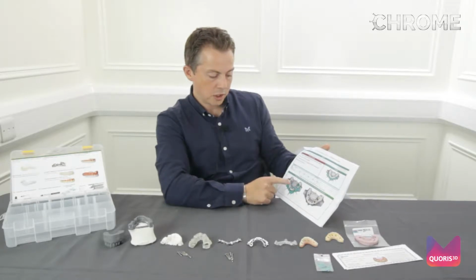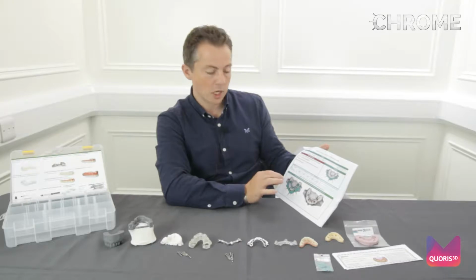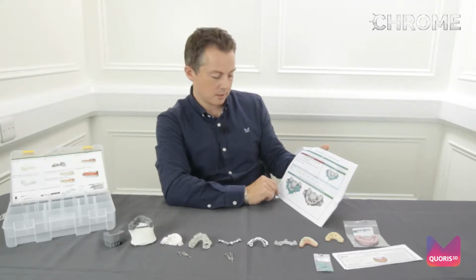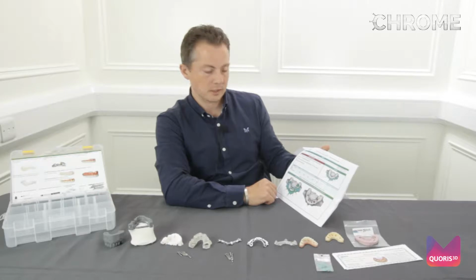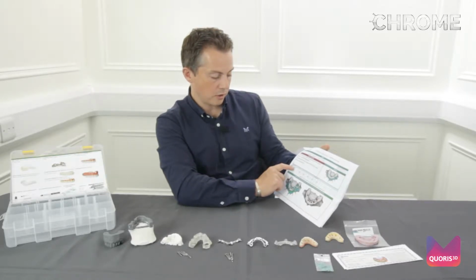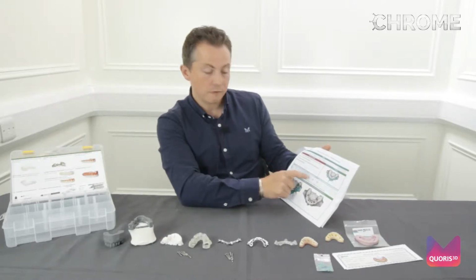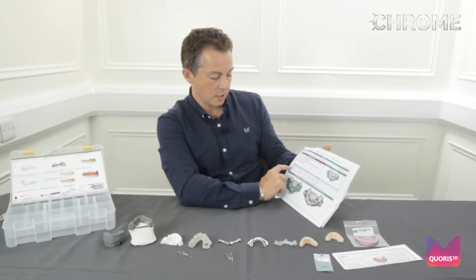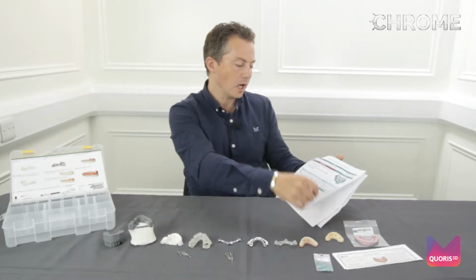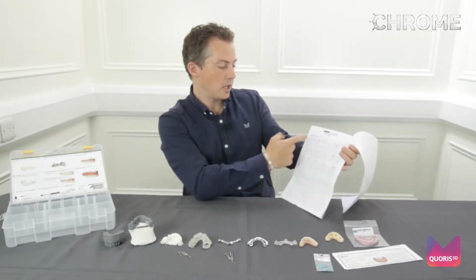guide. On the osteotomy guide, in this particular case, we have 3 hexagonal slots, and these are for angled MUAs, and 2 round, which indicate straight MUAs. We've also got the manufacturer of the implant, which we've already said is Neodent. We've got the implant site, in this case there's 5 implants. The size of the guided kit that's required, in this case is regular all the way across, and the final drilling depth.